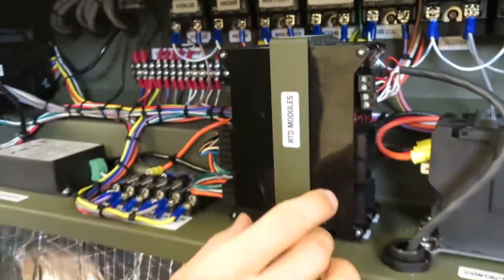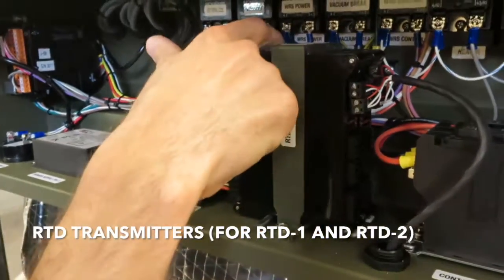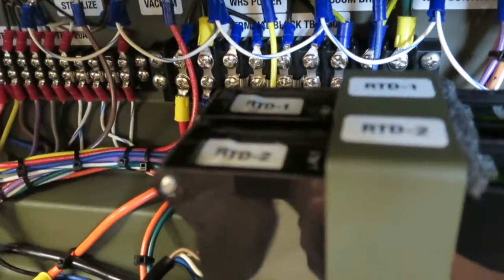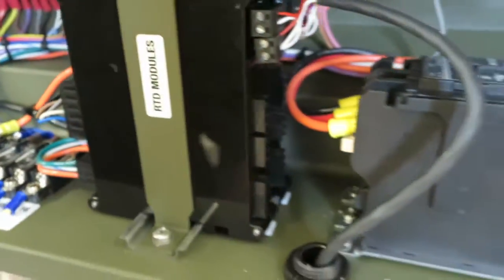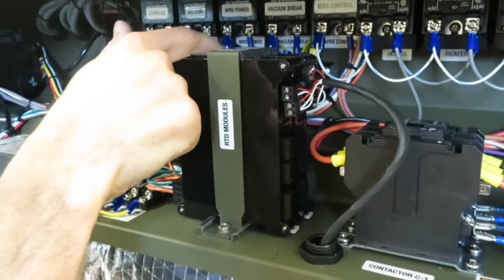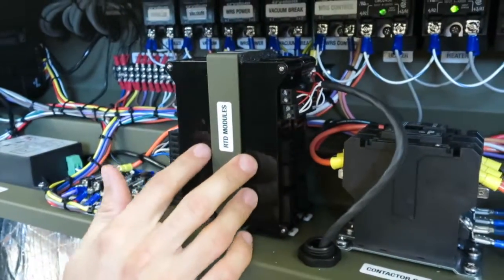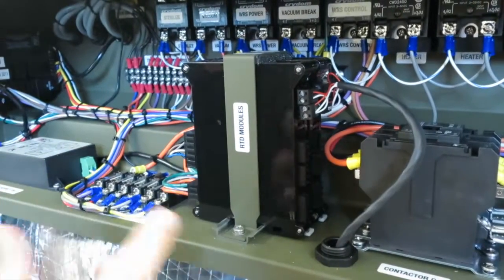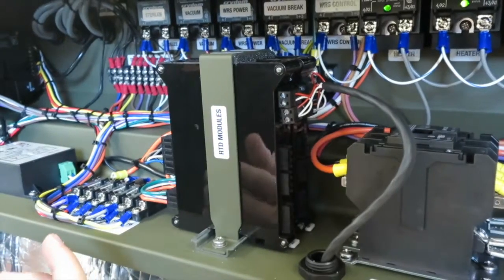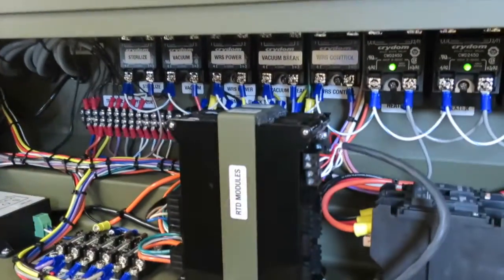Right here we have the RTD modules or RTD transmitters. There's a number 1 and number 2. Again, the number 1 is correlated to the number 1 element in the RTD probe. That's what the sterilizer is controlling off of. Number 2 is constantly checking it. So during a cycle, during exposure, number 2 is checking up on 1 and making sure it's reading the correct temperature.